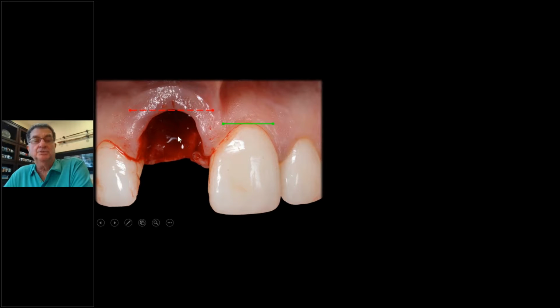But they got palatal tissue, and you got the proximal tissue. And so we got rid of the implant, and we got rid of the tooth. That's the key. You got palatal tissue and you got papilla height. And that combination lets tissue come down and we'll form a new ridge.